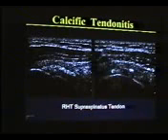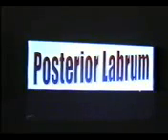In chronic tendinitis, you will see irregularity of the tendon along with calcified areas. There is a calcification, another small calcification, and a large calcified area within the tendon. Here we have another scan. We can see multiple calcified areas showing chronic tendinitis.